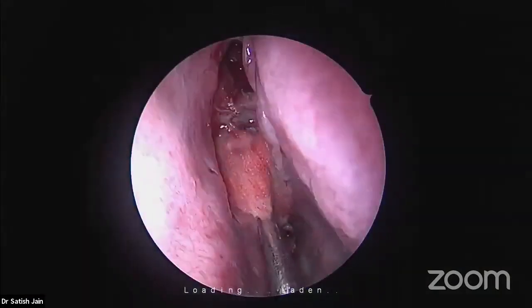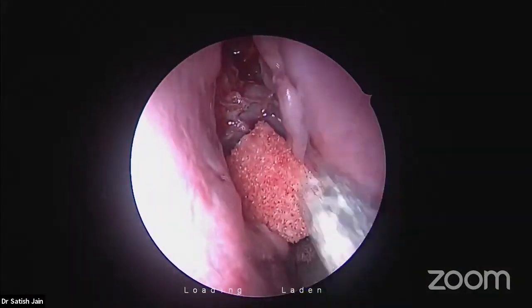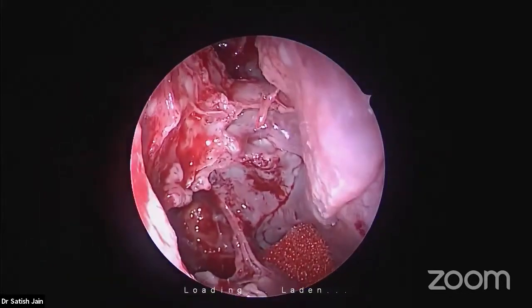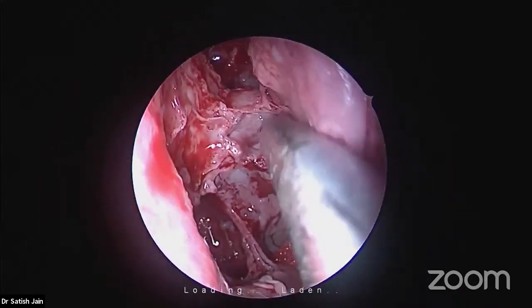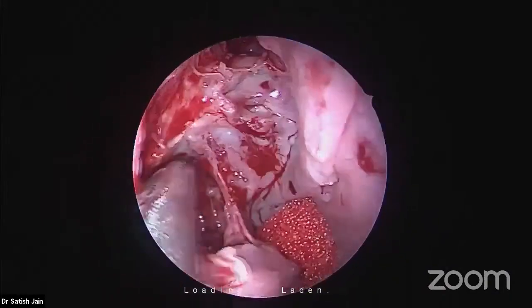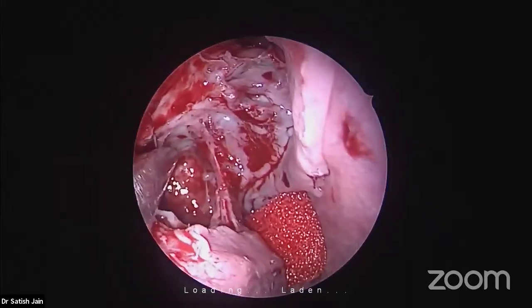And after the bulla, now this is the ground lamella. See how the turbinate is containing it. And we all know this is an important landmark because to enter the posterior ethmoid, we need to go behind it. Now, before going to the posterior ethmoid, I will do certain things and show some important landmarks there.